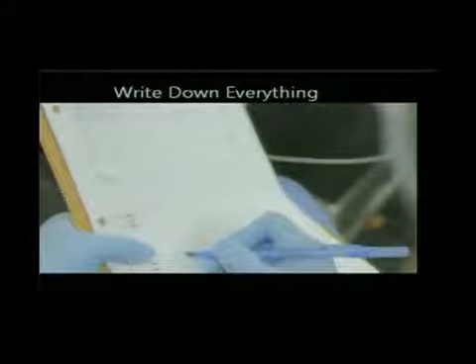And then back to documentation, just to emphasize, you document, you document, you document, you write down everything. These little dots here, this is the systolic pressure. Actually, that's the heart rate there. He's going to be putting in the diastolic pressure down here. These are coming in every 5 minutes, so every 5 minutes he's writing this down. What was happening during the procedure? This is a responsibility to the patient. This is also part of good care, so if there's a trend, he can see it in his own document.